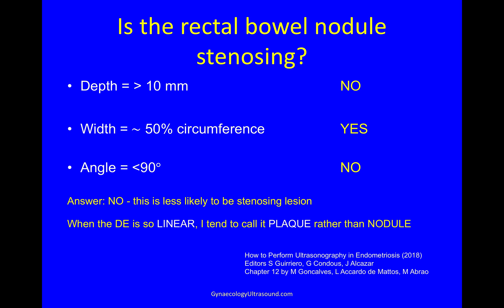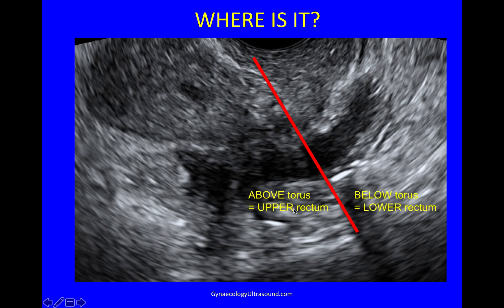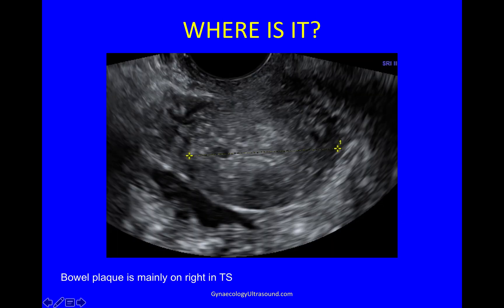This is a book I can highly recommend — that's where I got these surrogate markers for bowel stenosis from. So we know what it is. Where is it? Looking again at the uterus, how will I describe where this bowel lesion is? Drawing the torus, you can see that the abnormal plaque extends on both sides of the torus. The bowel above this line is called the upper rectum and below it the lower rectum. In the transverse plane — it's such a useful plane to look at the relationship between different tissues — you can see it's mainly on the right.